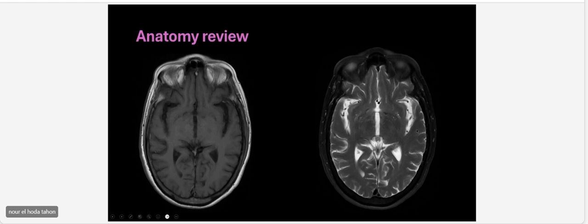And also, I want to tell you, did you see this? I know it's very, very tiny, but there is maybe a cyst, or see here. There is some bright signal here, and it's dark here in the area of the basal ganglia. Here and there, and it could be normal, it could be abnormal. Can anyone guess what this is? A small vessel disease.